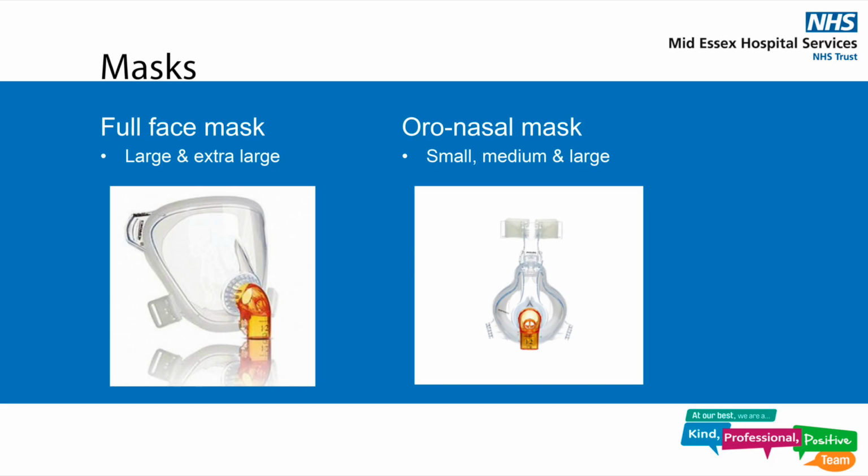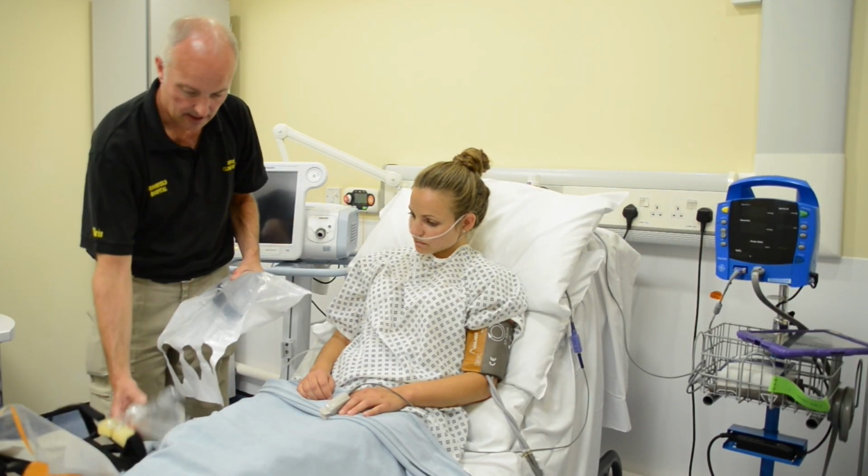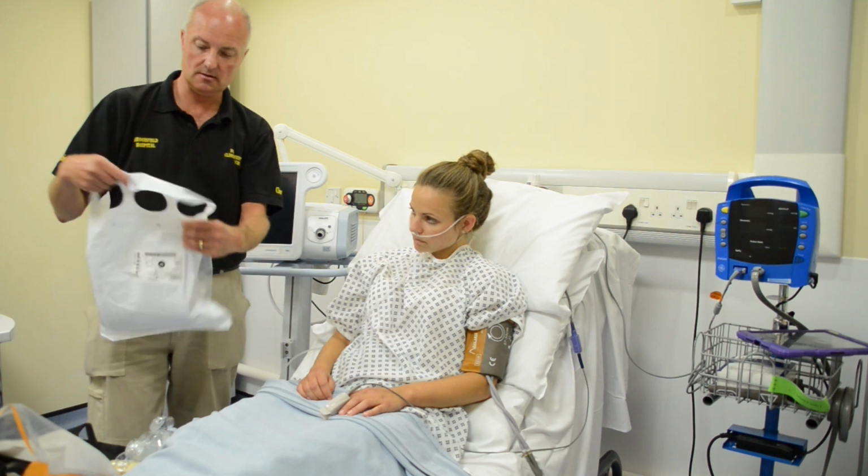At Broomfield Hospital, there are two types of mask available: a full face mask or oronasal mask. Both come in different sizes, so it is important to measure your patient before opening a mask.